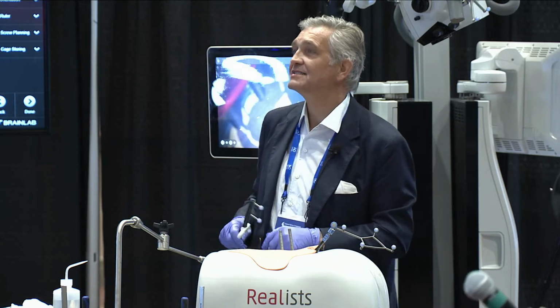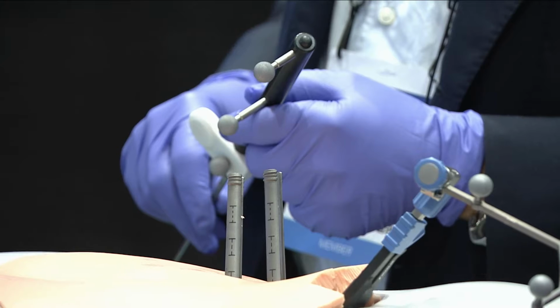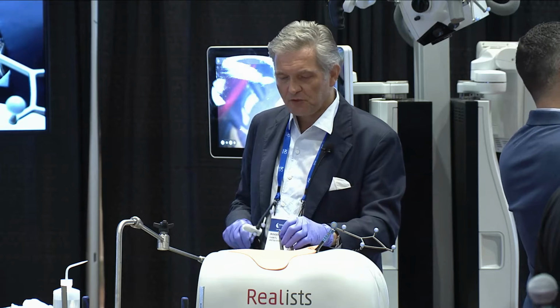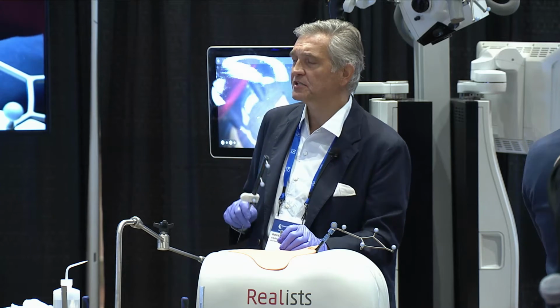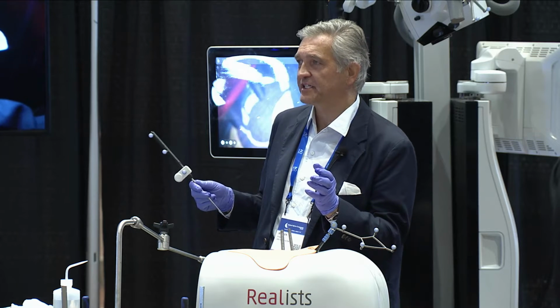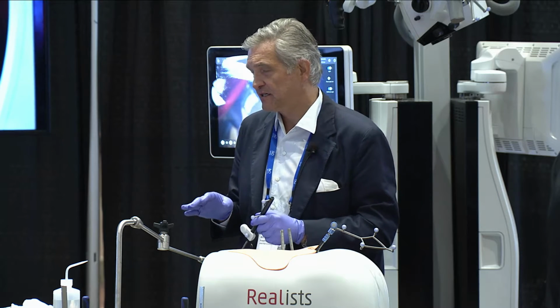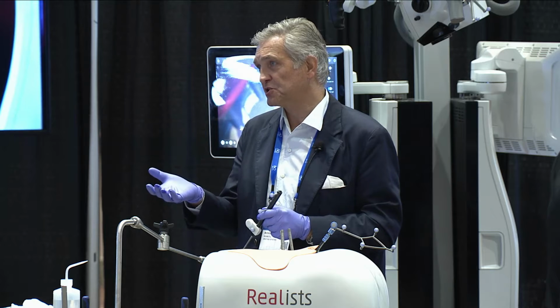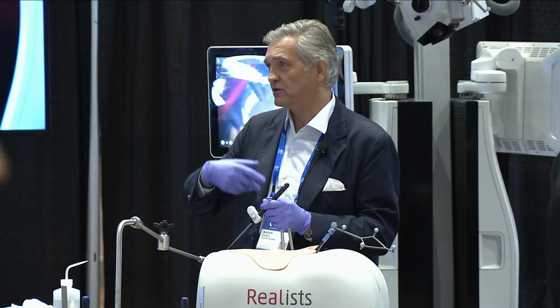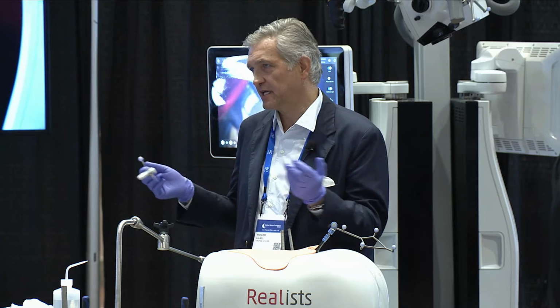Yes, there's a question. Thank you, Roger. I'd just like to ask you one question. Why do you want to put your screw first and then do a laminectomy after that? Yeah. What is the reason? You can do it either way. I like putting in the screws first because I want to have maximum accuracy in terms of navigation for that part, because I do everything with navigation. Let's say if I did the laminectomy and the cage first, that would change the accuracy of the navigation, and then I would have to get another spin or re-register. So it's really for that reason. But you could do it the other way around too.